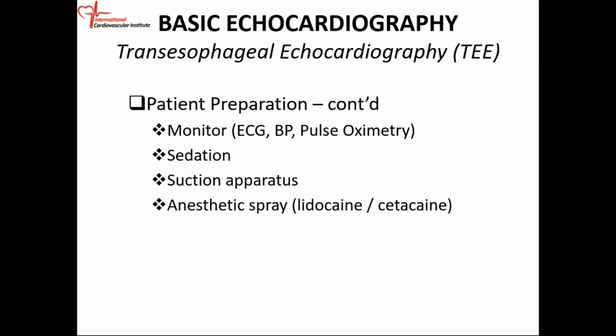So you have your sedative, know what you're going to use, make sure you have a reversal agent, and then your anesthetic spray. We usually spray the back of the pharynx, the back of the throat, with lidocaine spray.